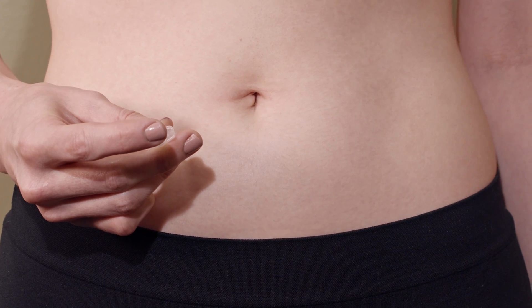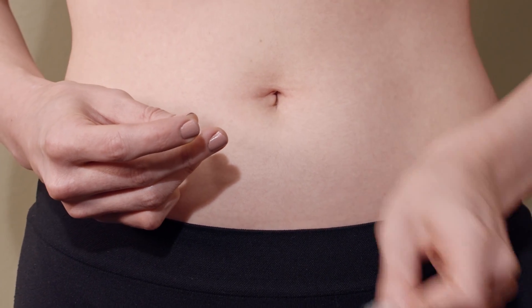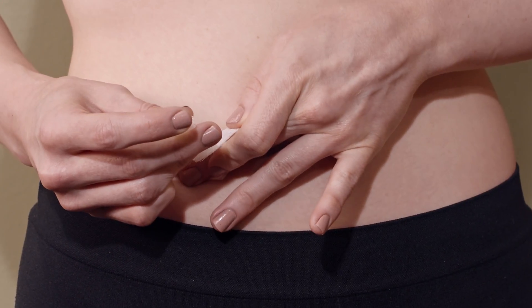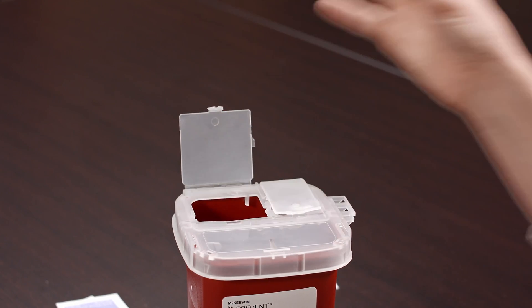Push the plunger until all of the medication is administered into the injection site. Gently remove the syringe and apply pressure with the gauze. Dispose of the used syringe into the designated sharps container.